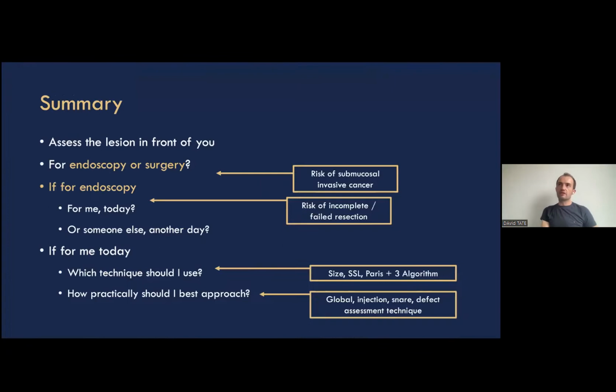So I just want to summarize the presentation. Hopefully we've done about 15-20 minutes of presentation, and we are going to take you through the following things. Really importantly today, we are not focusing on decision-making about hot and cold, en bloc or piecemeal, snare types, diathermy use, and technique, and I hope that you will invite us back to talk to you about those. But today, what we want to reinforce is looking at the lesion in front of you: is it for endoscopy or surgery? And that is really the risk of submucosal invasive cancer. It's also the difference between piecemeal and en bloc. That's really only based upon submucosal invasive cancer. And we're going to talk to you now through many examples of how to make that decision.